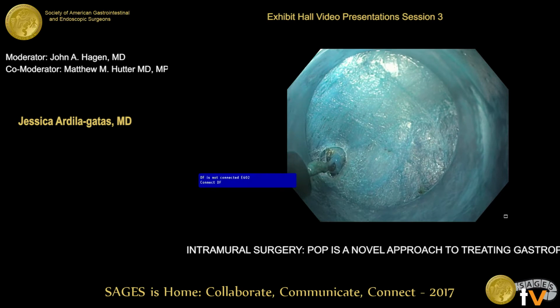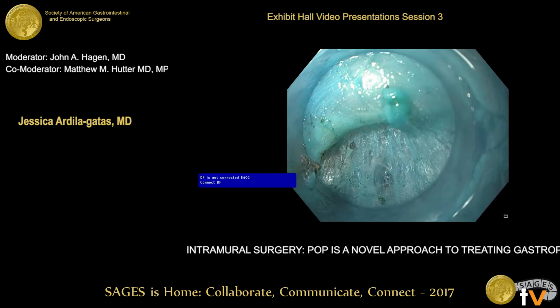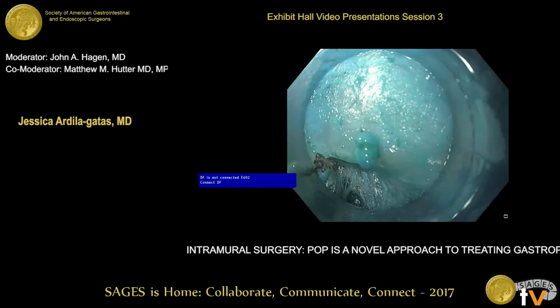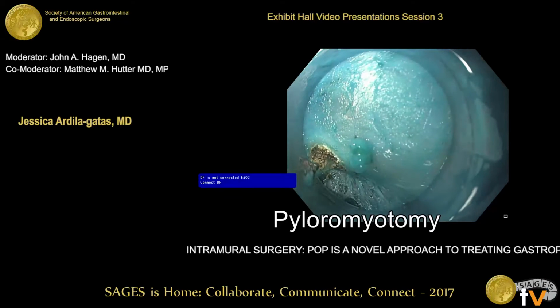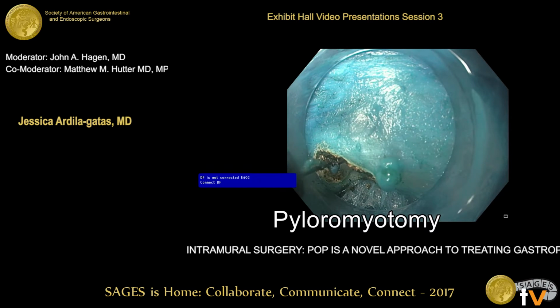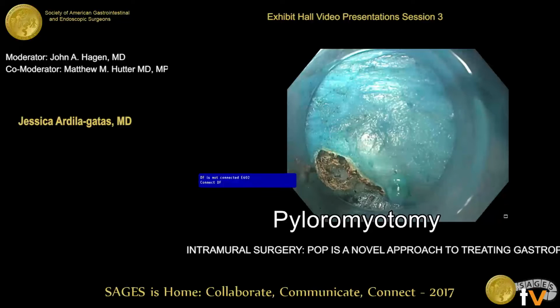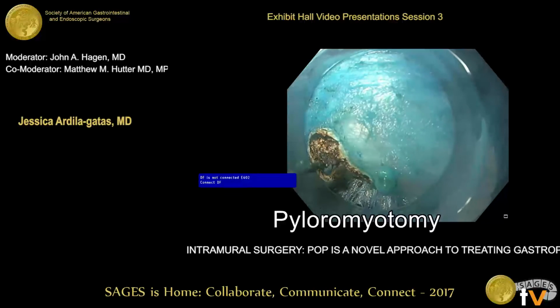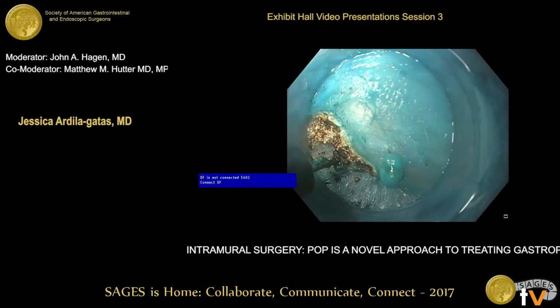Now we proceed to create the submucosal tunnel using electrocautery and constant insufflation of CO2. So we create the tunnel along the muscle just distal to the end of the pylorus. Then we proceed with the pyloromyotomy. We use electrocautery to transect the muscle layer by layer, and we like starting distal to proximal.